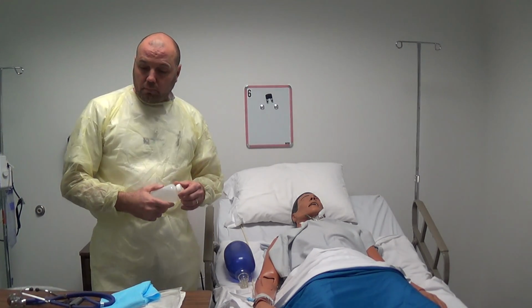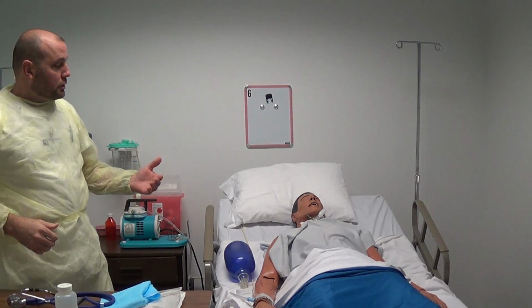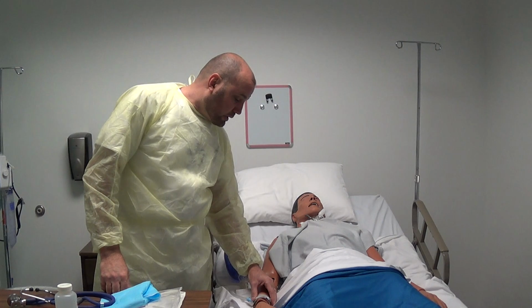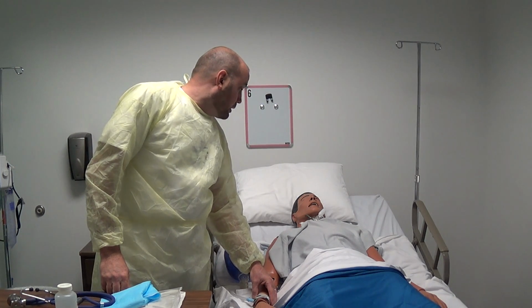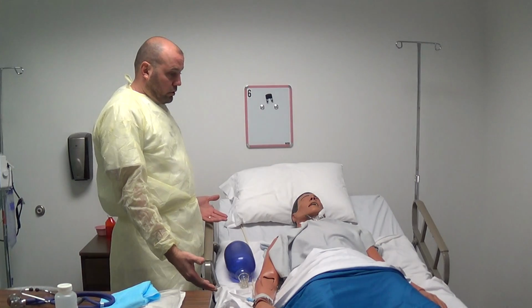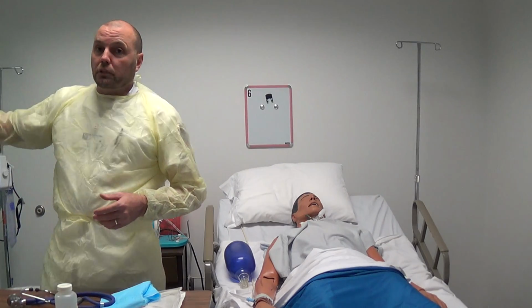date and initial it. So I'll go ahead and from the beginning, I've knocked on the door. I've introduced myself to the patient. I'm going to confirm and verify the patient's identification, which he's capable of nodding. First name, Joe, last name, Smythe, and his date of birth. I've also checked his medical record number. I've raised the bed up for proper body mechanics to a comfortable working position, and I've provided patient privacy.